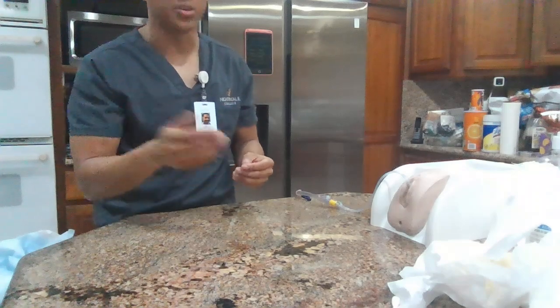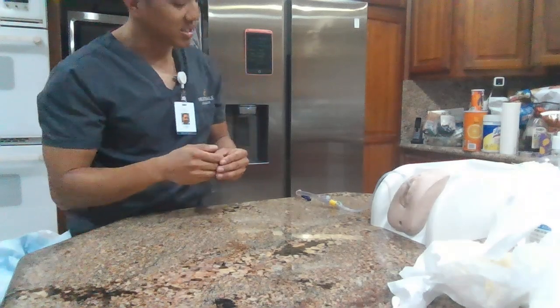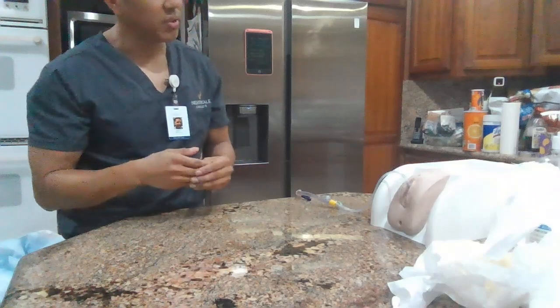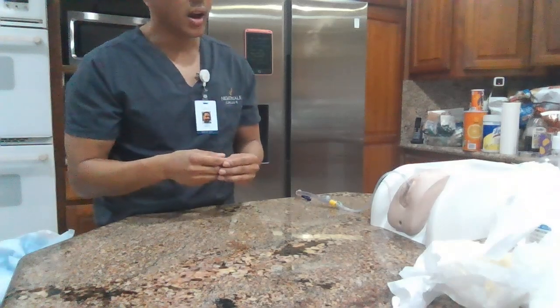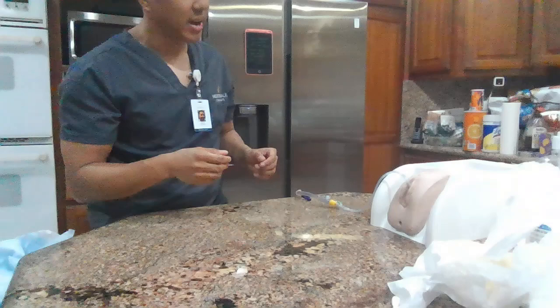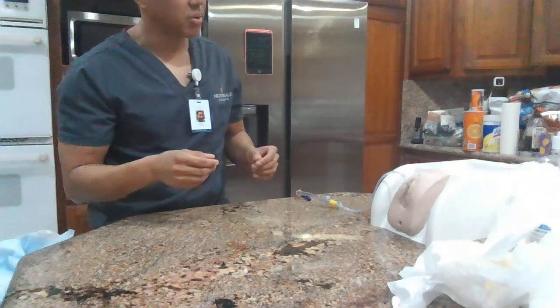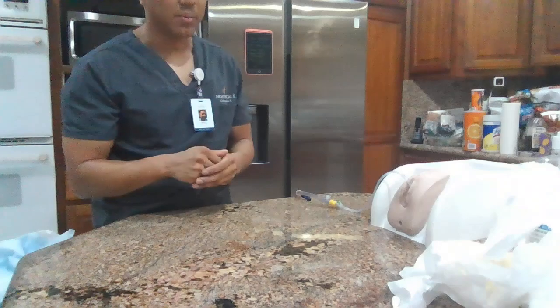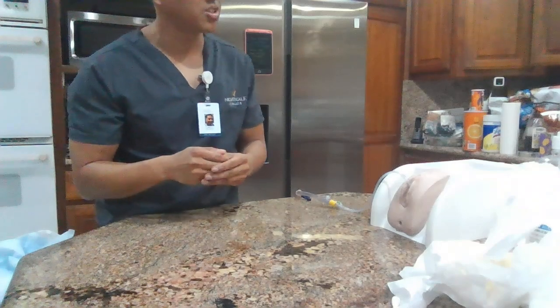I'll continue to come in and out just to assess if you have any obstruction or any discoloration in your urine. And if you're planning on moving around your bed, please make sure you have enough slack so you're not pulling on your catheter. If you have any other questions, I'm going to be doing my documentation. Thank you.